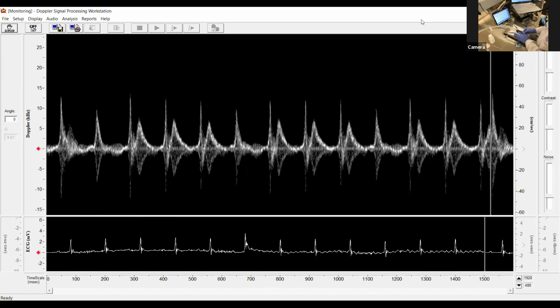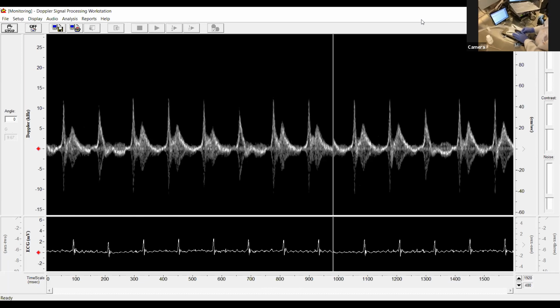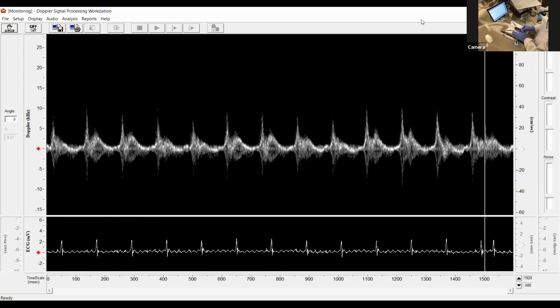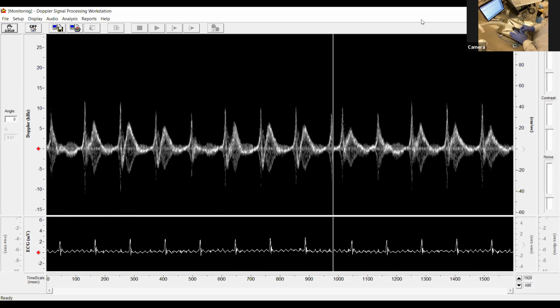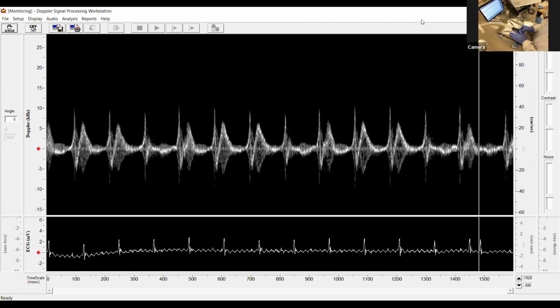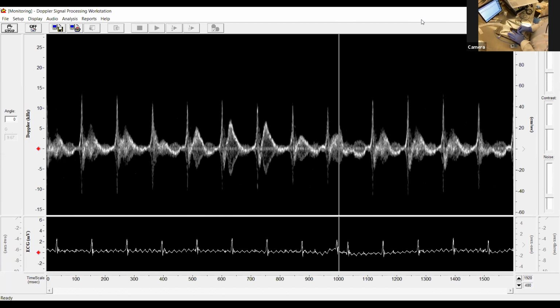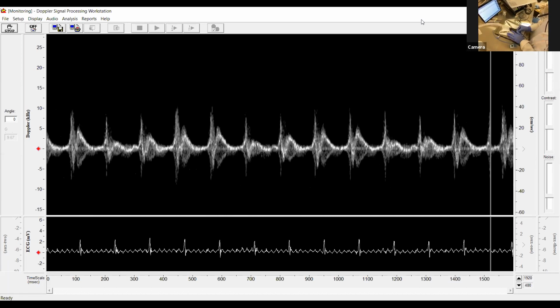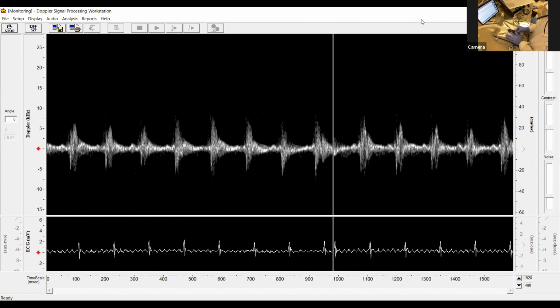So we're starting to see a nice strong signal there. Okay, so we see a nice strong E peak. The A peak has an odd shape, but again, these are mice that may or may not have a normal genotype. So this is the challenge that we face at times with the animals that we have access to. But I'm gonna see if Sydney can dial that in a bit better.